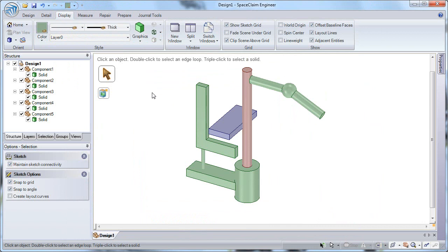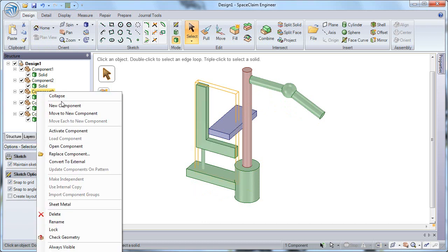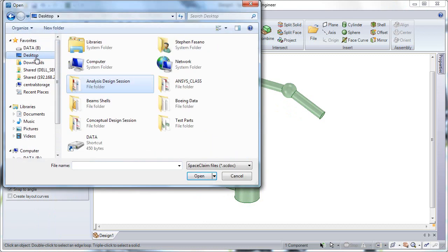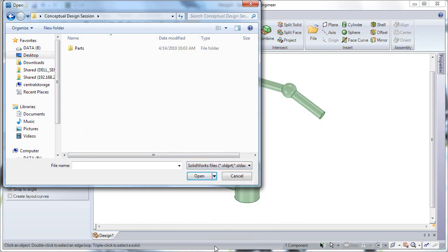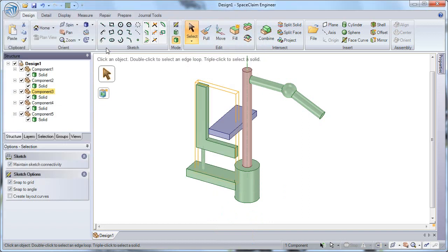So this is a basic shape of our design, but we can also specify some more advanced components. So for example, for the chair component, I have a more detailed model designed in SolidWorks, so I can right click on that component, choose Replace Component, and now search for the SolidWorks component that I'd like to replace it with in the File menu that pops up. You can see from the drop-down the list of various CAD formats that SpaceClaim can read in. So we'll toggle for SolidWorks files, and it'll show us SolidWorks files in our file browser. When I find that office chair assembly, I'll bring that in.